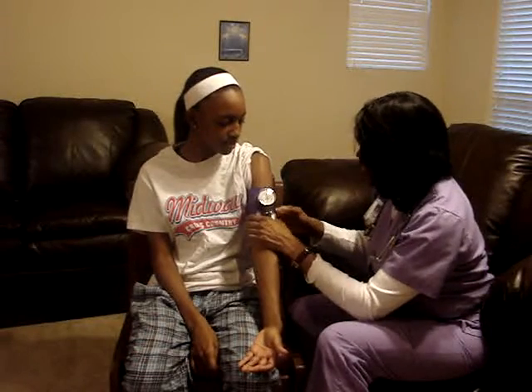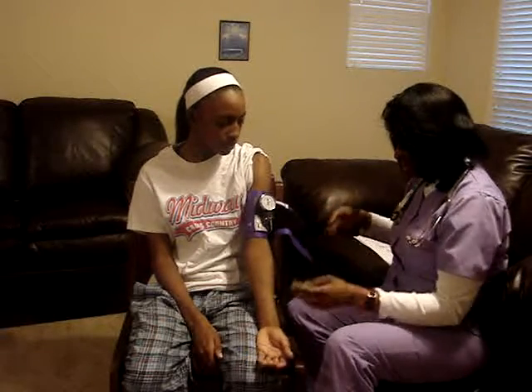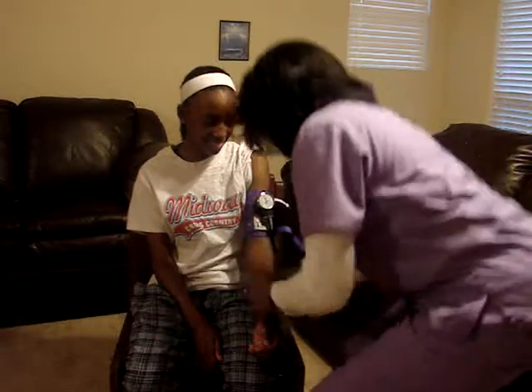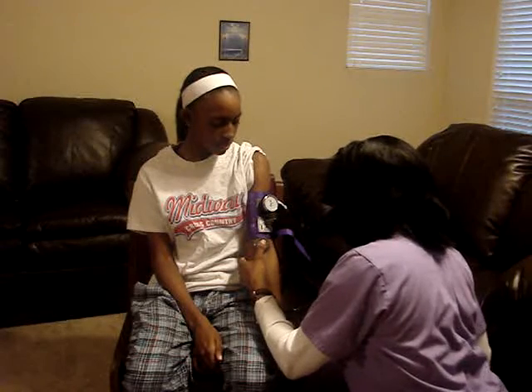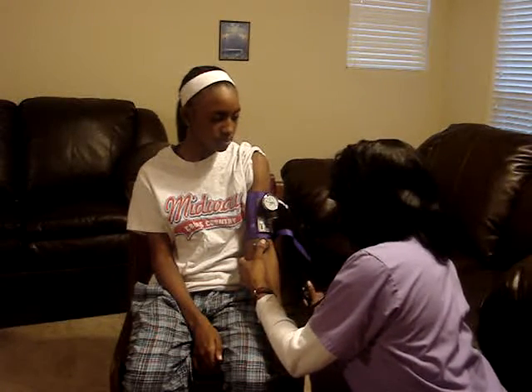Alright, Hillary, I will replace the cuff on your arm, so just hold it out there for me. Oopsie, sorry. Let's put this back on, so I'm able to read your blood pressure. Make sure my arrows are lined up with her artery, and then we'll put the cuff on nice and firmly. Now if you'll just relax your arm, Hillary. I'm going to take her blood pressure at this time, and I'm only going to go up to about 120.